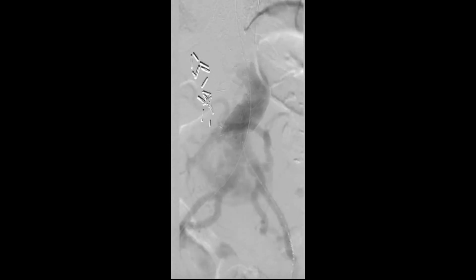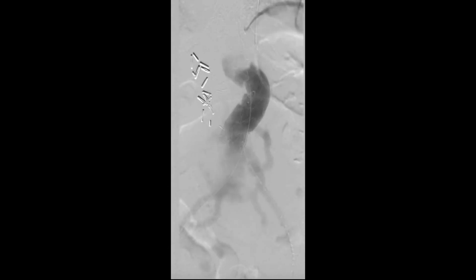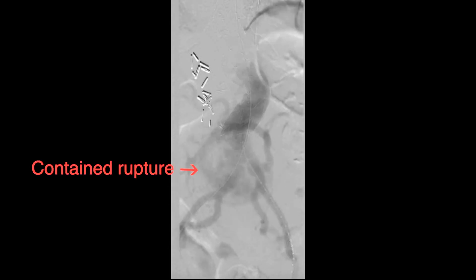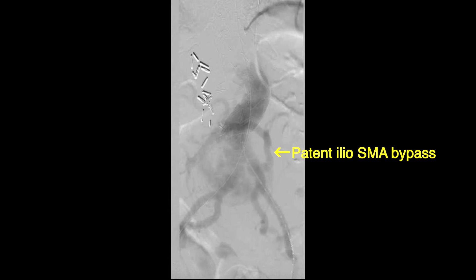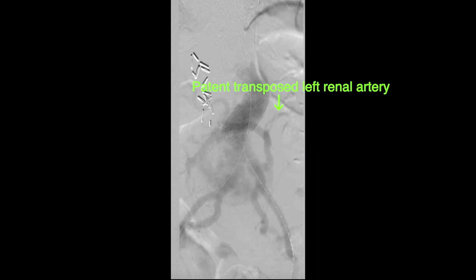The decision was made to perform an endovascular repair of this contained rupture. After gaining access to the superficial femoral artery, a pigtail catheter was introduced and an abdominal aortogram with runoff was performed. Demonstrated here is active extravasation resulting in a contained rupture, along with a patent left ilio-SMA bypass and a patent transposed left renal artery onto the bypass limb to the SMA.